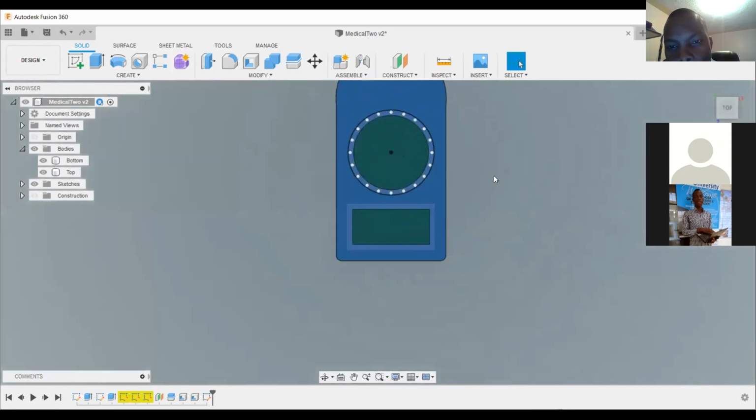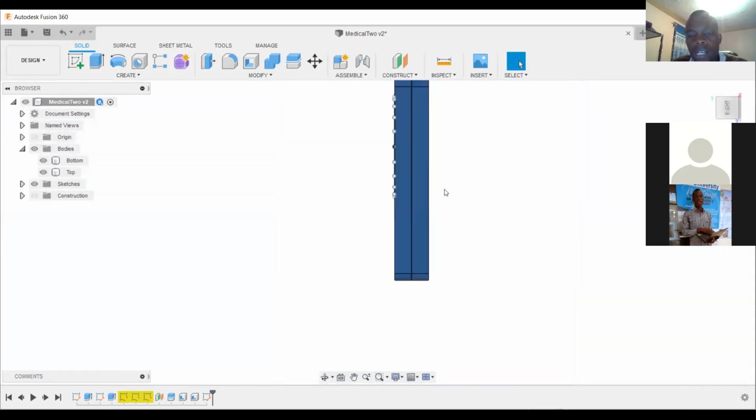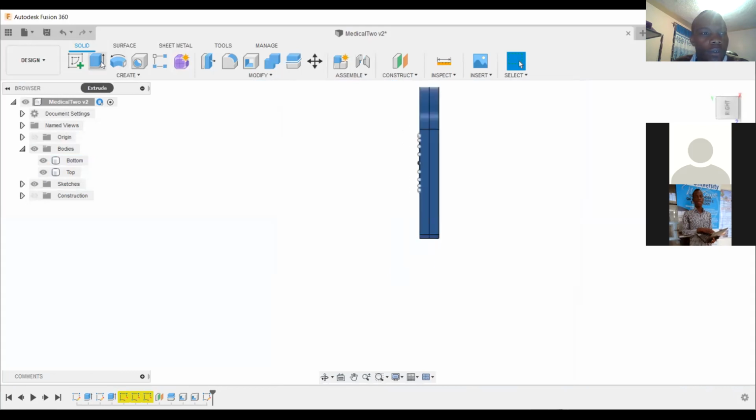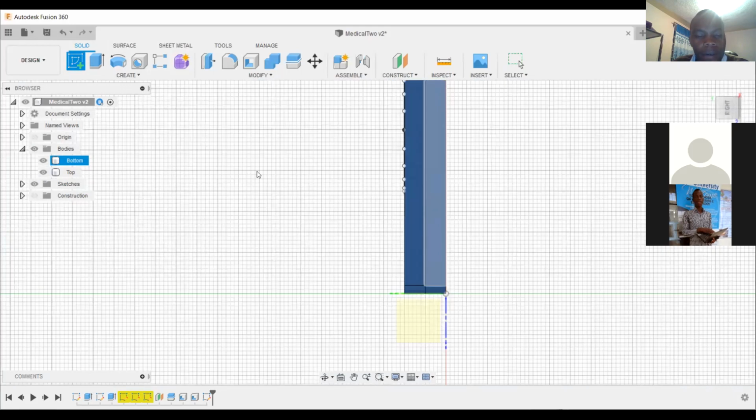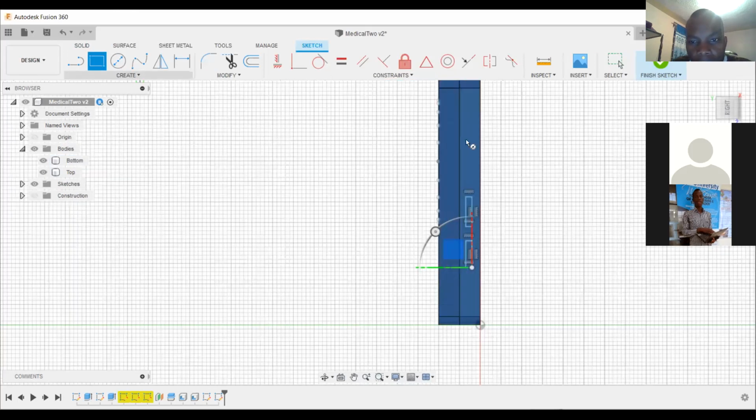Everyone, are we together? Yes. Okay, then on the sides, we want to learn extrude cut. Extrude cut is simple. You create on the side, like think of it like where some buttons come in. We had done extrude cut anyway. You can draw something like that. Think of them like even your phone has got a volume rocker, for increasing the volume. Then maybe you can even have one which is circular. So those are the 3, 1, 2, 3.